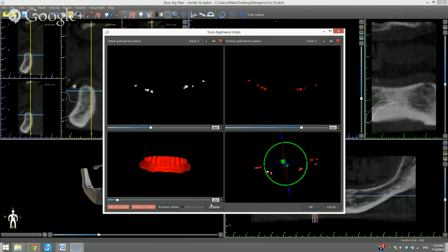We used to try to be compatible with different handpieces and to track that information, but because things are always changing with different companies, different handpieces, different drills, and different drill stops, it became impossible to do that. So we recommend buying the Blue Sky Bio handpiece. It's $285. You get the handpiece and the direct cut drill. The drills being used usually only need one drill per case. They're reusable, of course. They're $76.